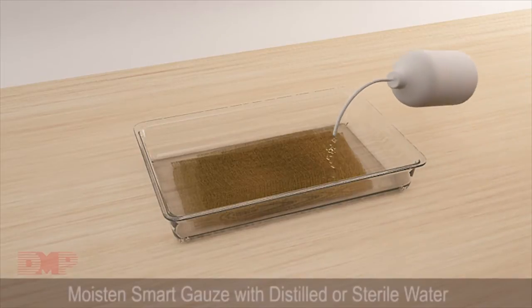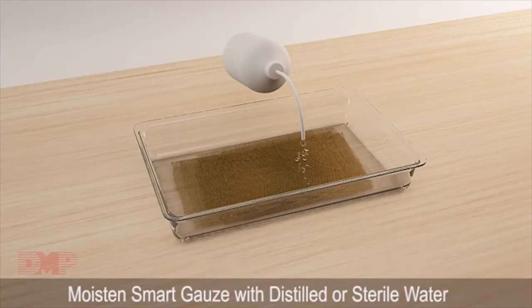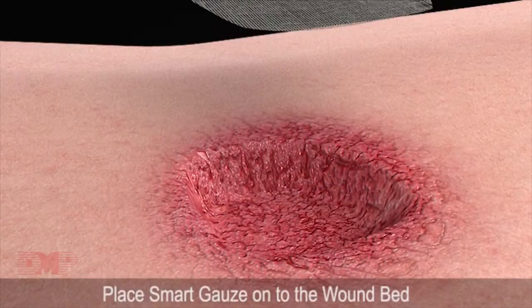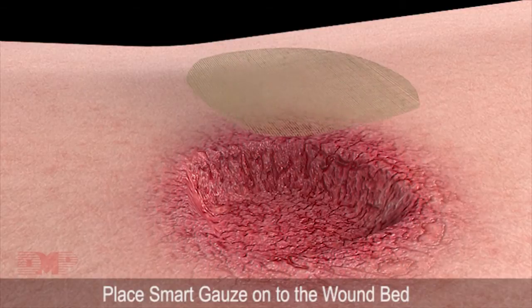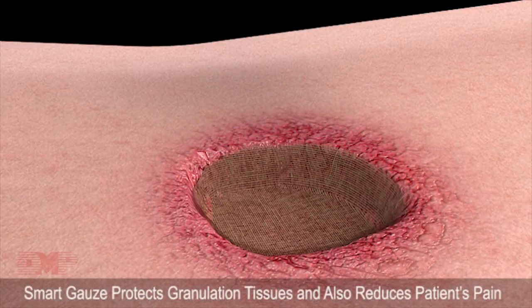Before applying Smart Gauze, moisten it with distilled or sterile water. Place Smart Gauze onto the wound bed. Smart Gauze protects granulation tissues and also reduces the patient's pain.